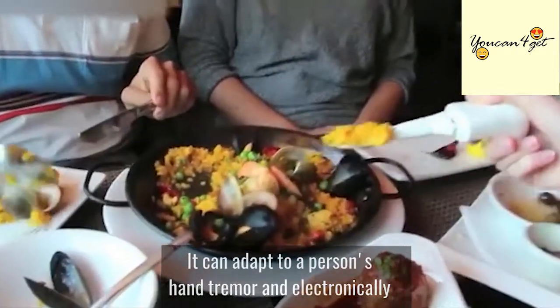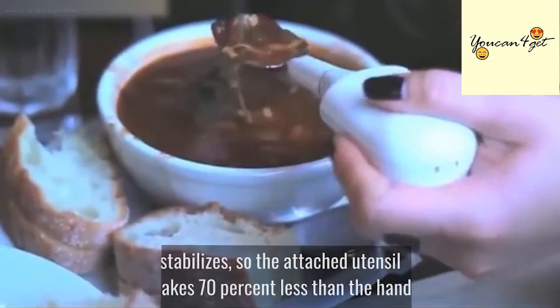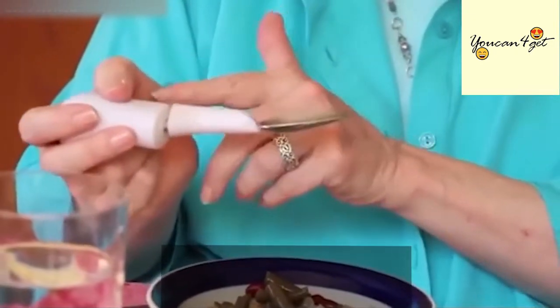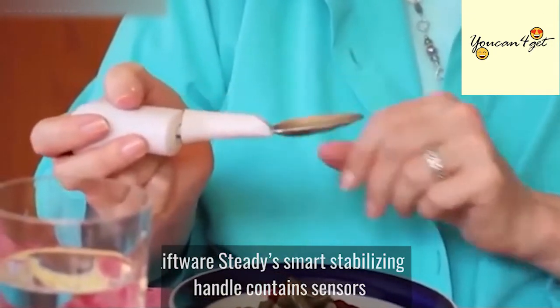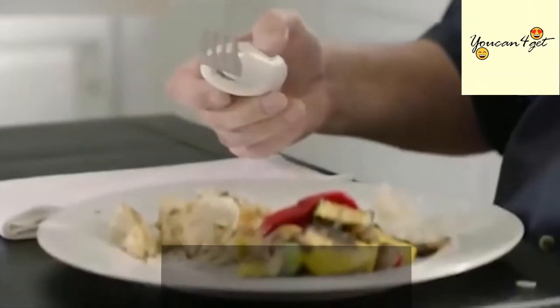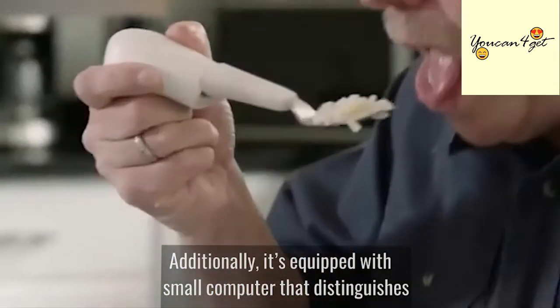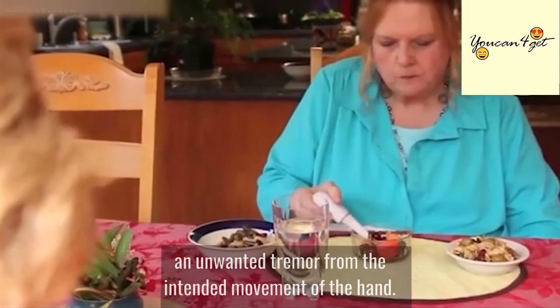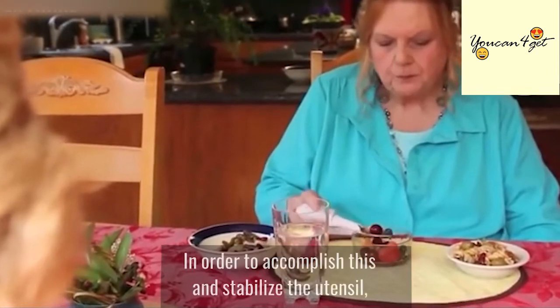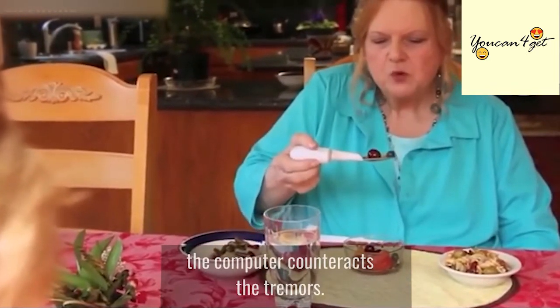It can adapt to a person's hand tremor and electronically stabilizes so the attached utensil shakes 70% less than the hand. Liftware Steady's Smart Stabilizing Handle contains sensors that detect hand motions. It's equipped with a small computer that distinguishes an unwanted tremor from the intended movement of the hand. In order to accomplish this and stabilize the utensil, the computer counteracts the tremors.